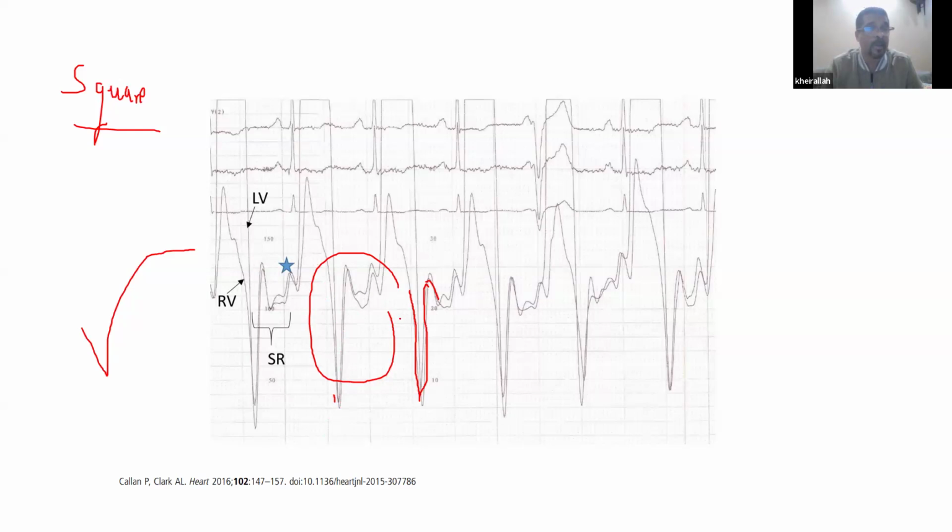The other thing is that when you look at the LV and RV pressure in diastole, they are kind of equal, which they call equalization of the diastolic pressure between the two ventricles. We know that right ventricle diastolic pressure is normally lower than the LV, but in constriction, because they are under the same influence, their diastolic pressures are equal. In restriction, no: the LV diastolic pressure is still higher than the RV diastolic pressure.